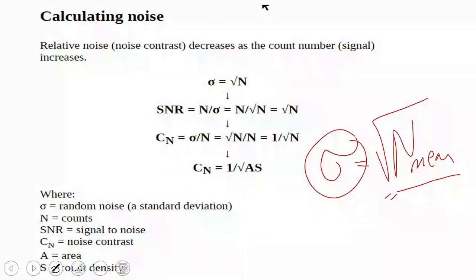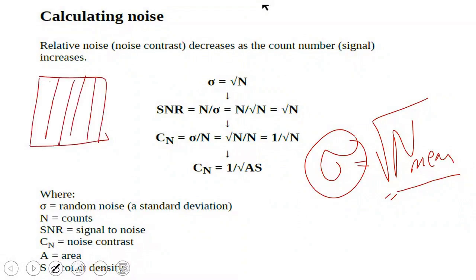This represents a quantity I call the quantum noise, or statistical noise. The statistical noise increases as the value of the standard deviation rises, which means the amount of variation in people's heights increases, and the amount of noise increases as well.